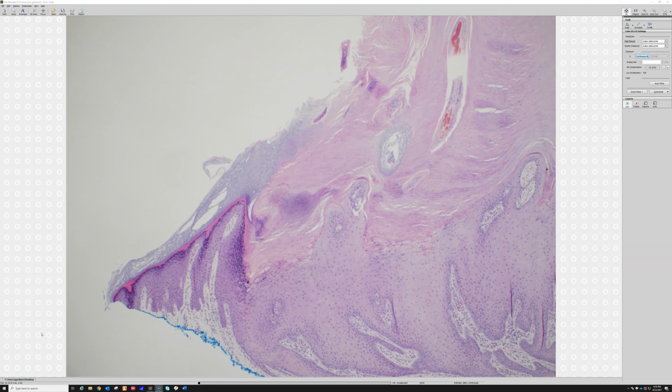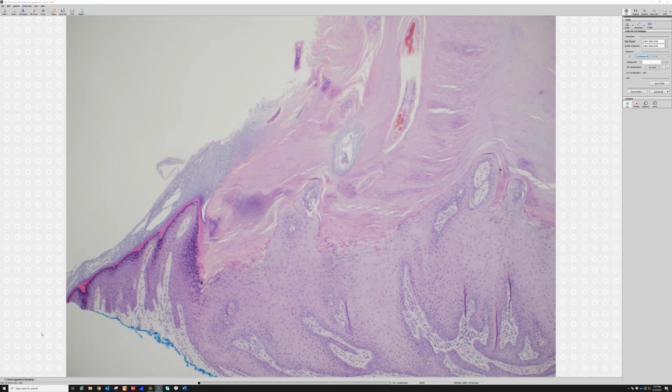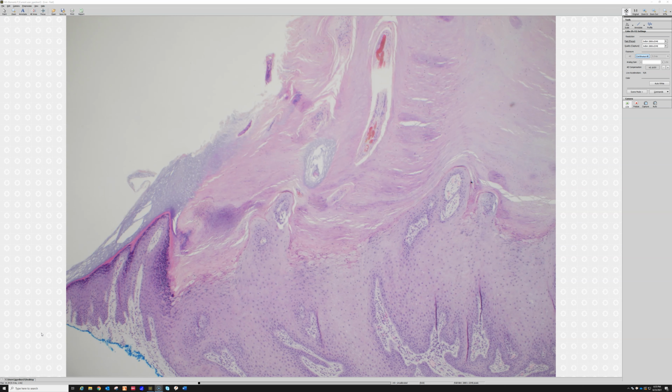So the reason, like I said, is that sometimes squamous cell carcinomas can have areas that look very much like a verruca on the surface. And I've seen that many times. And I have a whole video about squamous cell carcinoma and actinic keratosis. And I think I've got some examples in that video. And I also just released a short video recently. I'll try to remember to put links to these down below that shows a real nice example of a wart on the surface that looks like a wart and then actual full-blown squamous cell carcinoma underneath.